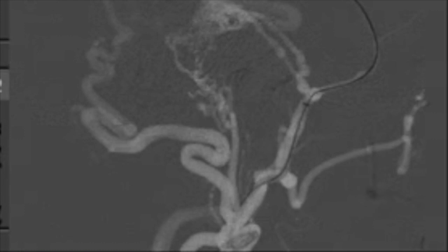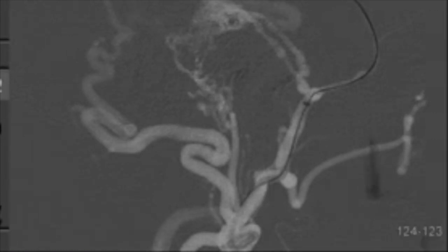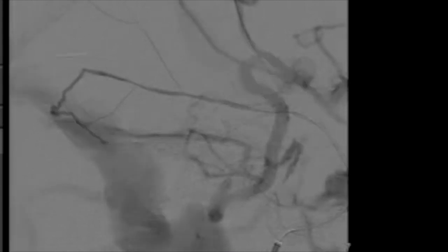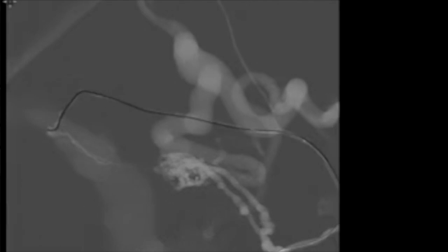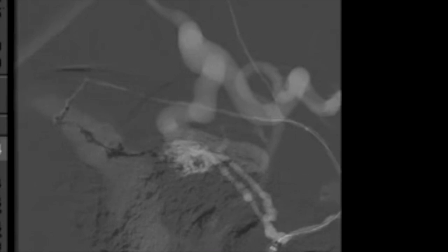Here you can observe the intermediate catheter advanced for more support. The middle meningeal artery is always the safest and easiest route to approach this tentorial or any dural AV fistula. The microcatheter is navigating through the middle meningeal artery to the proximity of the fistula, and we start embolizing slowly this large tentorial fistula.